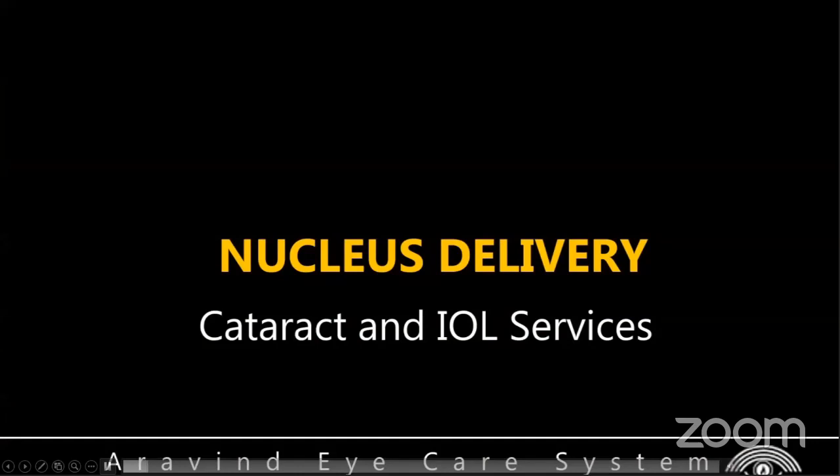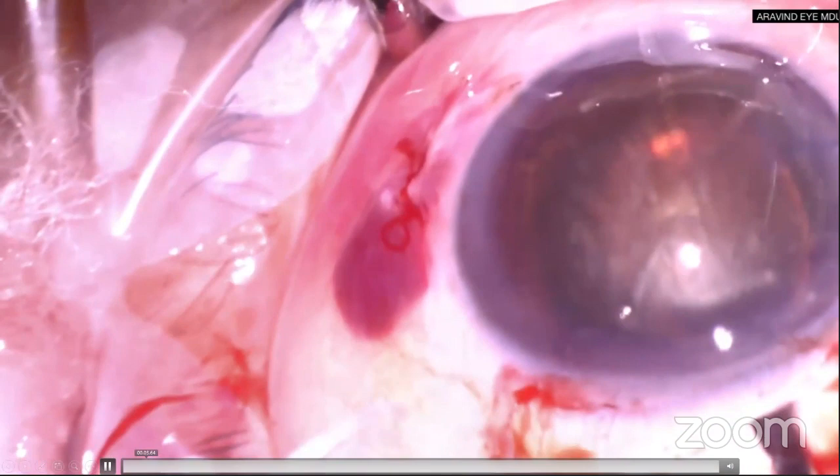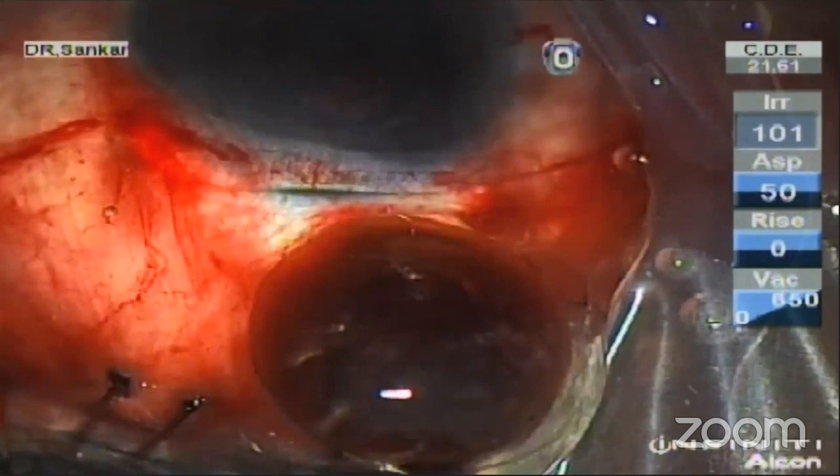Once the nucleus is prolapsed out into the chamber, we have to first check whether the vectis is patent. I mean, all the irrigating ports are opened up, and then we can always deliver the nucleus comfortably in a large, very well made tunnel, a very wide tunnel. But in case we have a nucleus that is stuck in the tunnel, we still have the option of wheeling it out using a Sinskey hook.